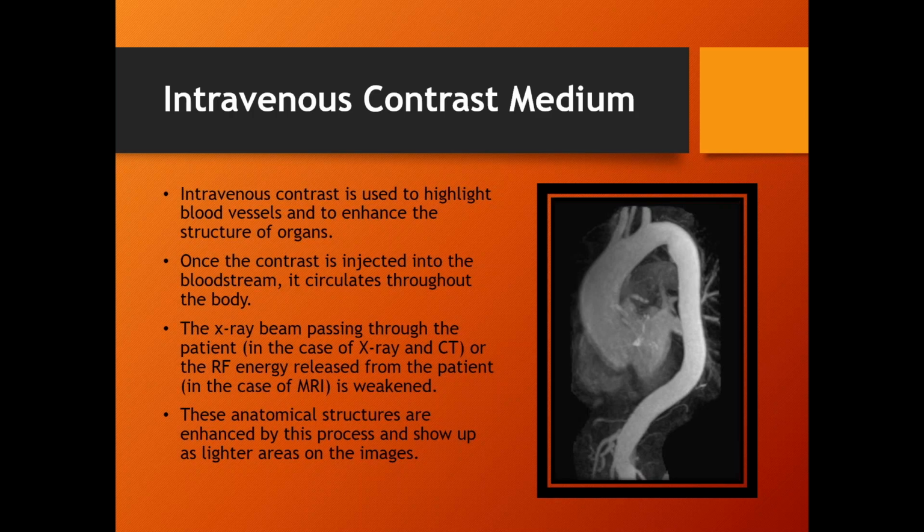So sometimes, like for CT procedures, they'll actually chase it. They'll inject just a small amount of contrast into the patient's body, and then the CT system will track it as it moves throughout the body. And so when you get your image, it looks like one long shot, when it was actually just chasing it. So we didn't have to fill the whole patient up. We just used this much and took images as it moved. Pretty wild. All right.